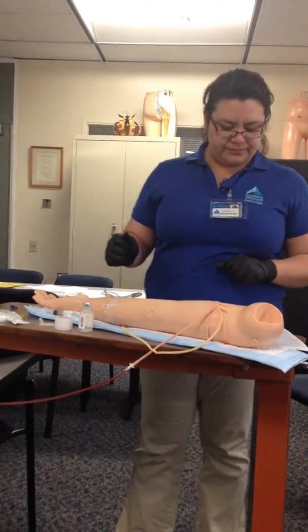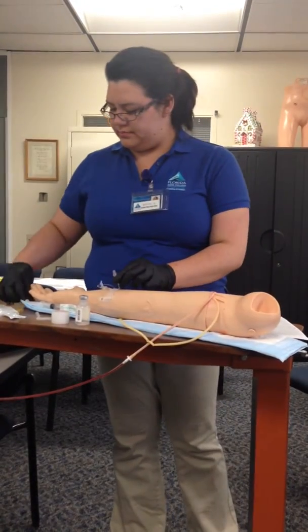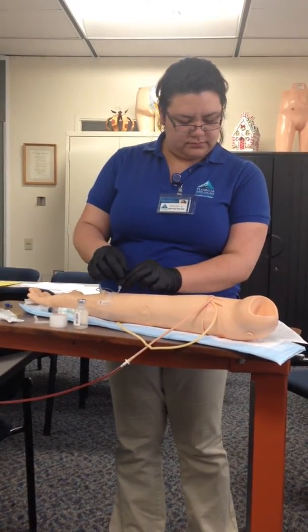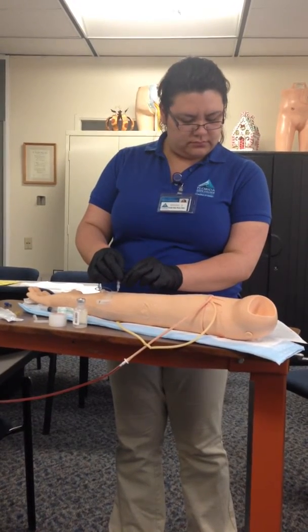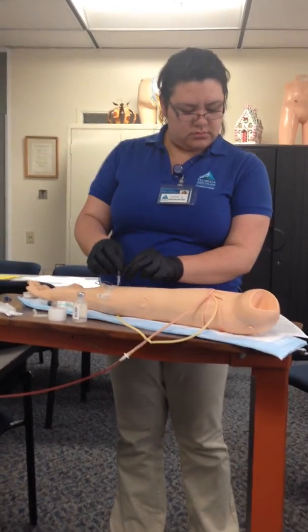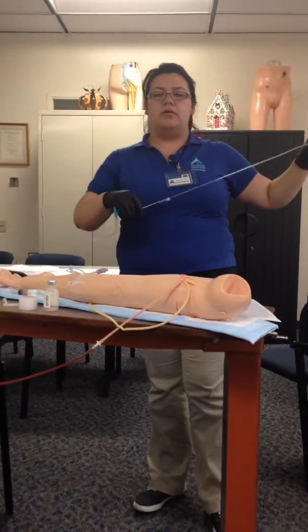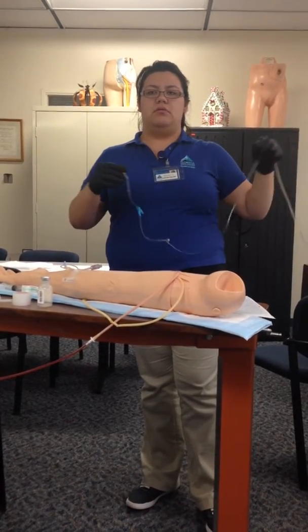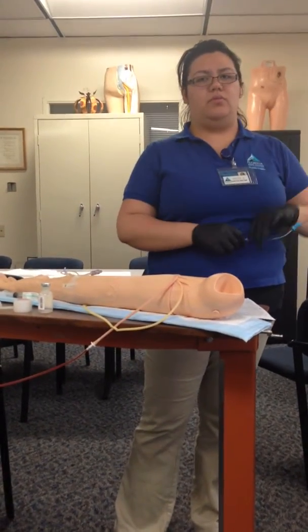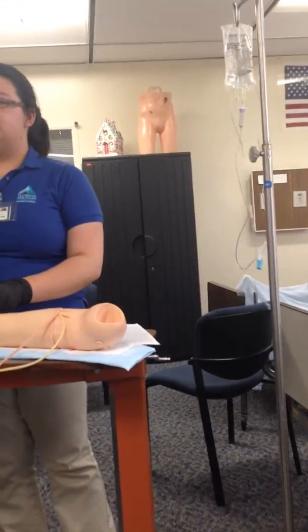So I'm going to clean the port with alcohol and then insert the needleless device.